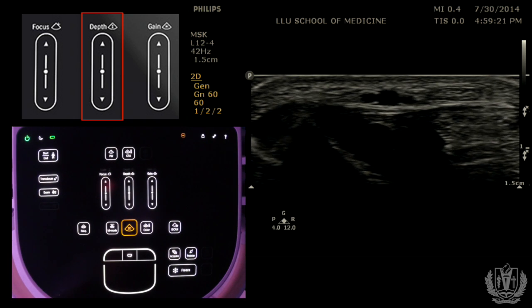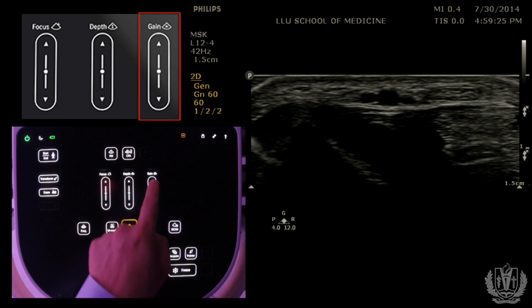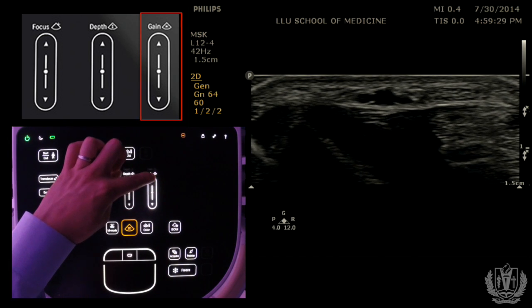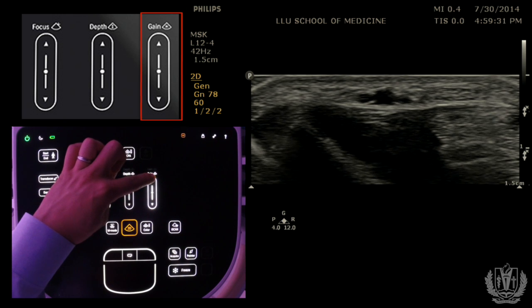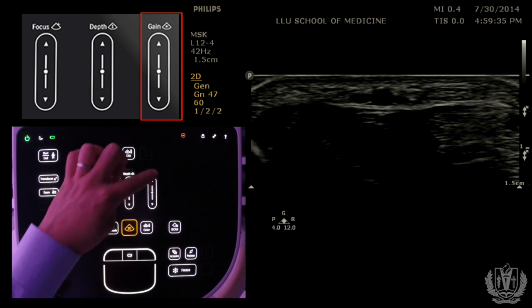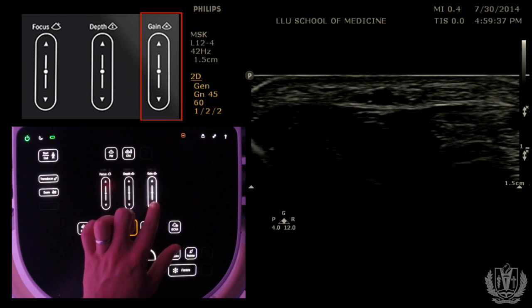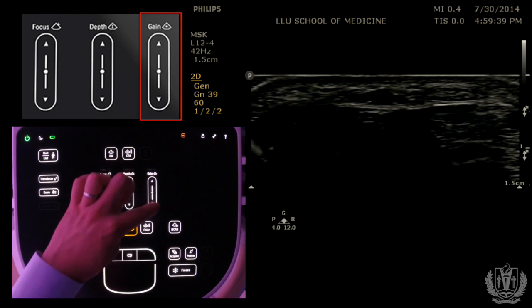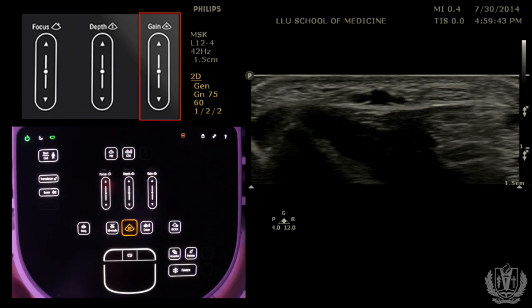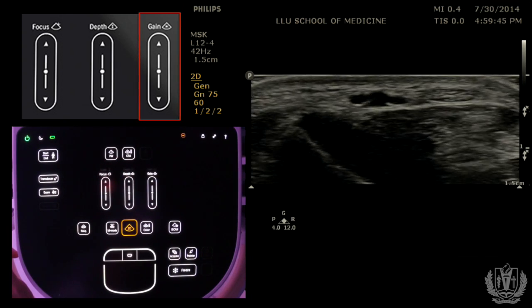Another important control to understand is the gain. The gain buttons are on the right side of the machine. If I go up, the gain increases and makes the screen brighter; if I go down, it makes it less bright. The gain basically adjusts brightness — you can tap or scroll up and down. Every machine will have a gain and a depth button; you just have to find where they are.